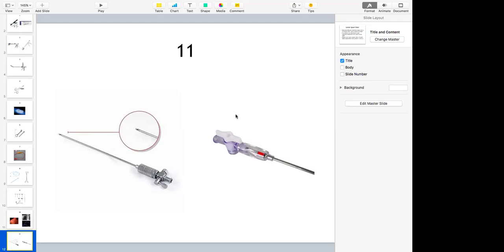The loss of resistance. Two clicks and then loss of resistance. And then you try to move the needle, it moves freely. And then you do aspiration and then give water injection, a drop of saline, drop test. Yes. And what is the flow rate?